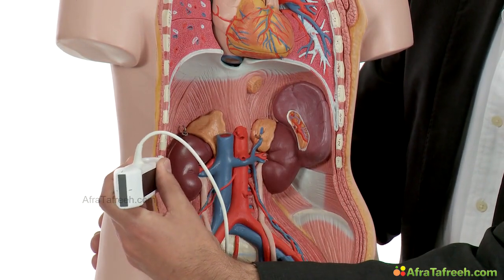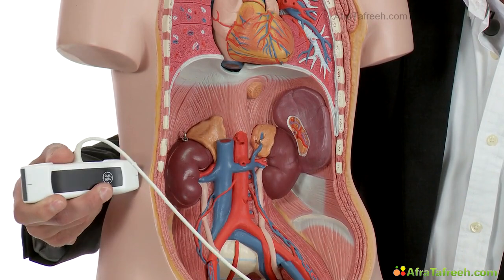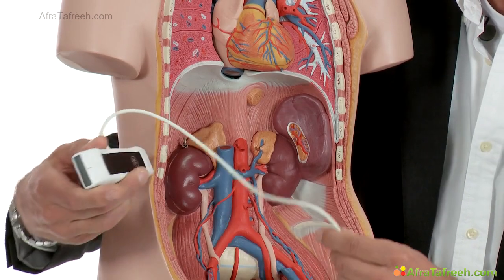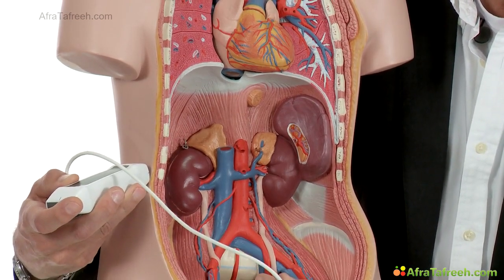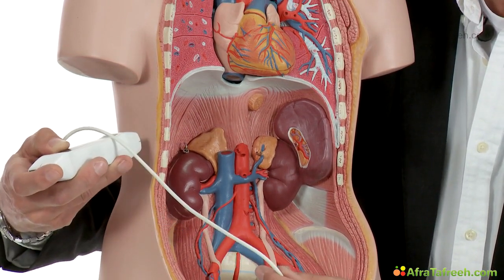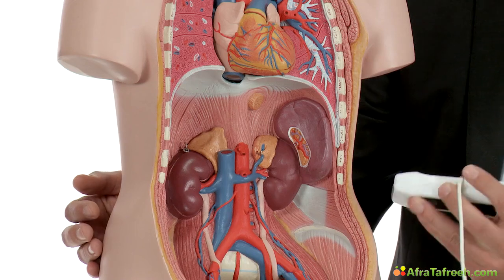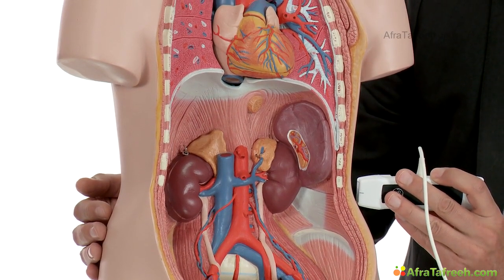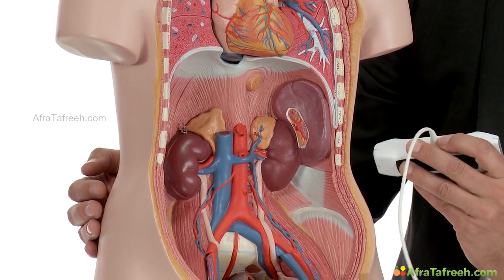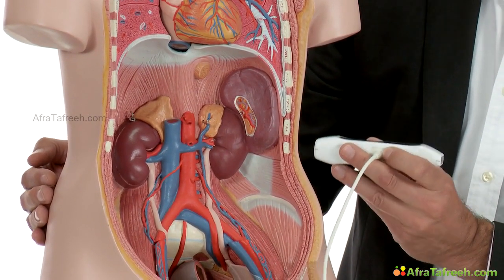Do it longitudinally, like that. Scan the whole organ by moving the probe back and forth, median and lateral, and then turn the probe counterclockwise to make a transverse scan of the right kidney by moving the probe down and upwards to scan the whole organ. The same is on the left side. You start with the longitudinal view, scanning the whole organ median and lateral, turning the probe 90 degrees counterclockwise, and then moving the probe up and down.